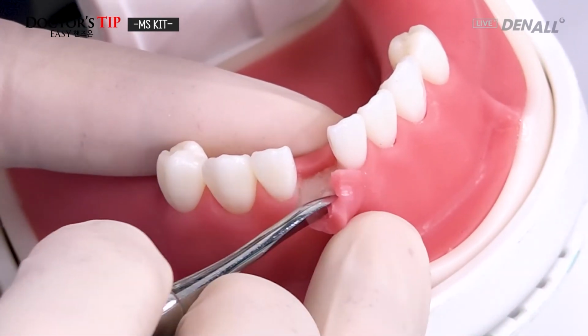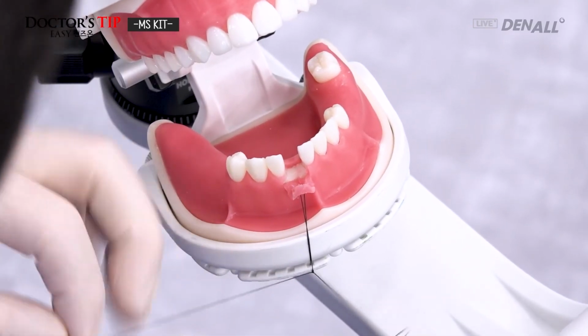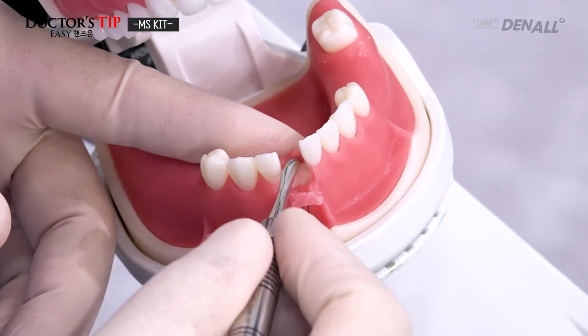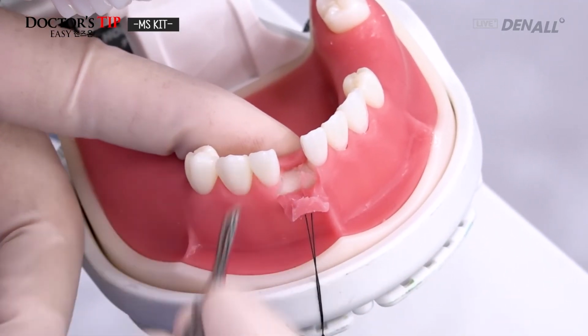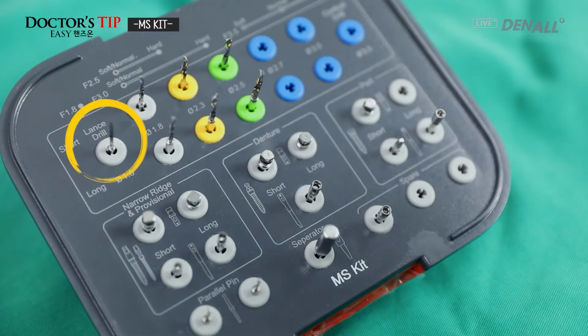So, just for easy hands-on, I will do suturing and tacking suturing. And as you can see, on the lower side, in number 41, like this, I open the flap, and the thickness here seems to be sufficient, and I'll use the lance drill and mark the drilling position. So the lance drill is used.